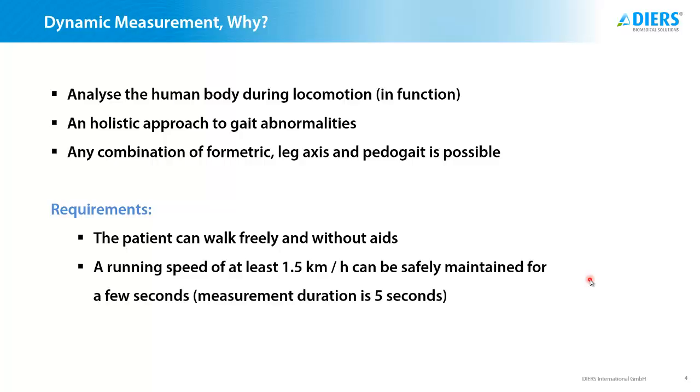And the reason I'm saying this is because all gait labs at the moment are still limited to the use of markers, to the use of cameras, but without going into detail in the spinal function. Our system is the only system that allows you to do locomotion measurements, including the posture and the spine itself.